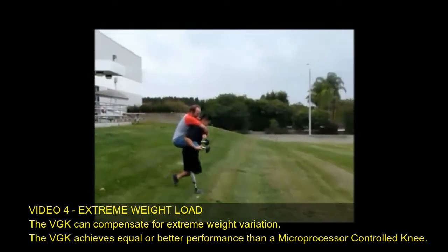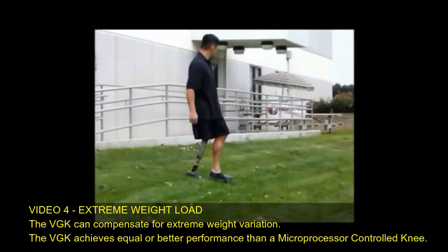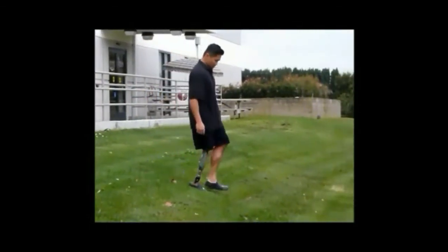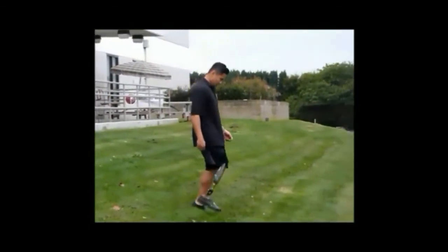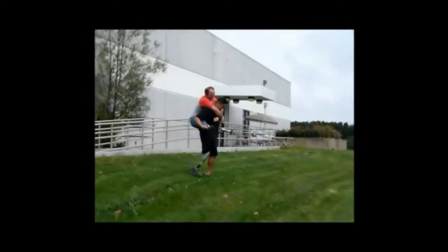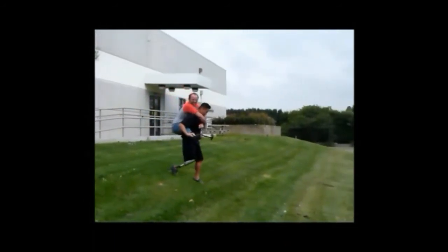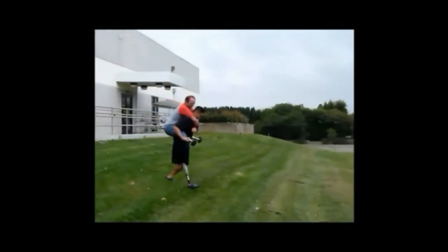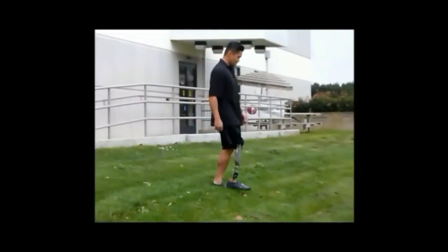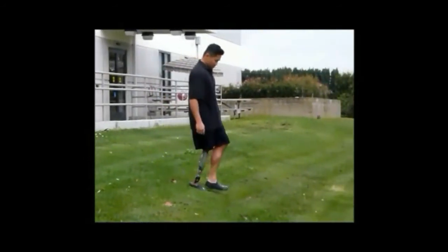Now, he heard my lecture, and in my lecture, I talk about the VGK can add an extra 35 pounds and still function the same. So in other words, they can put on a backpack and still walk fine. Well, he didn't have a backpack. But pay attention to the knee. Pay attention, particularly in slow-mo, what happens with the knee. Self-evident.